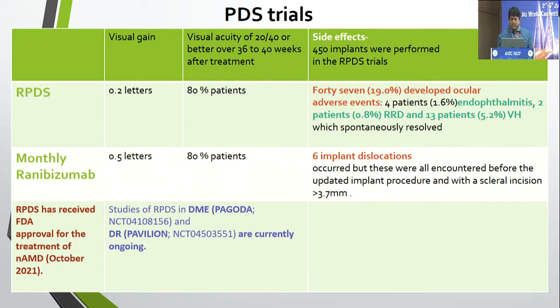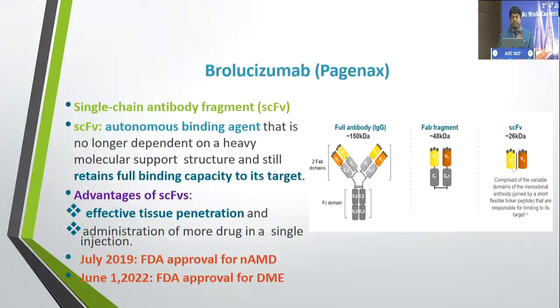However, few adverse events are noted with that implant, like few incidences of endophthalmitis, rhegmatogenous RD and vitreous hemorrhage, and also few instances of implant dislocation.